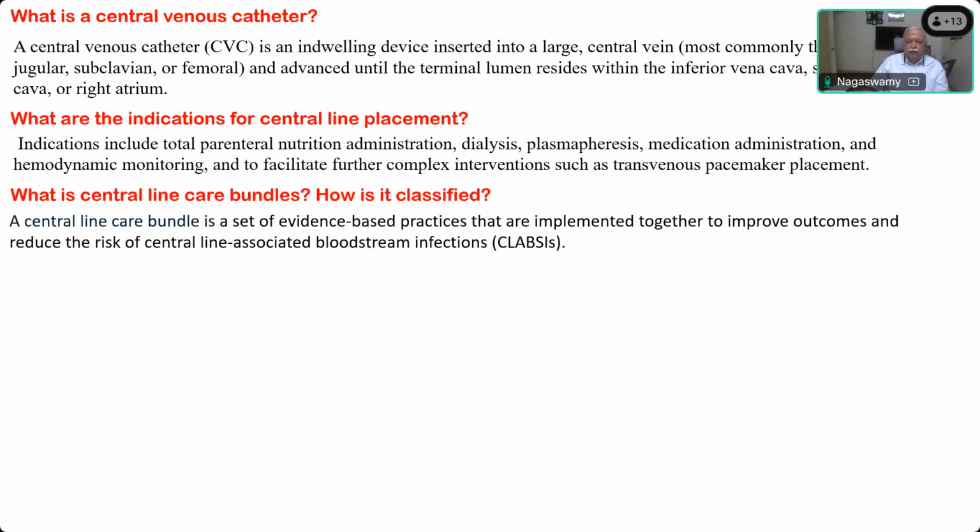Because the patient will be conscious. This is usually done under local anesthesia, and you cannulate the vein, either ultrasound guided or blind anatomical technique, whichever way you are doing. Supposing something goes wrong, a trainee is given the opportunity and inserts it into the carotid instead of the IJV. How will the nurse stop the person doing the procedure without the patient knowing that something is wrong being done on them?